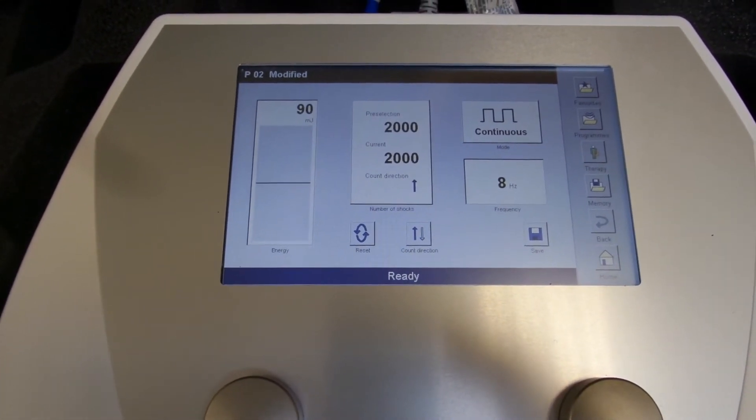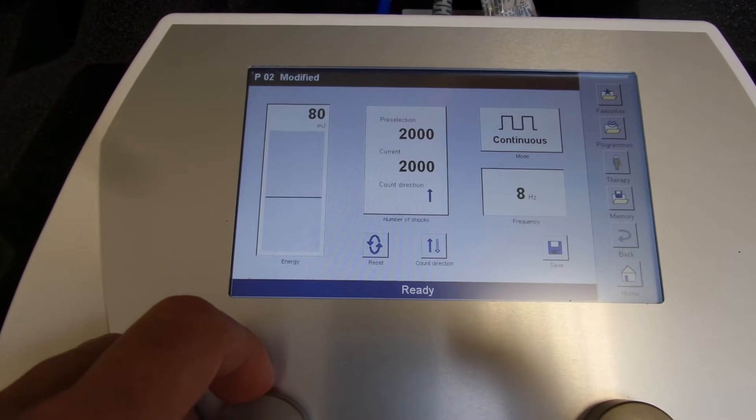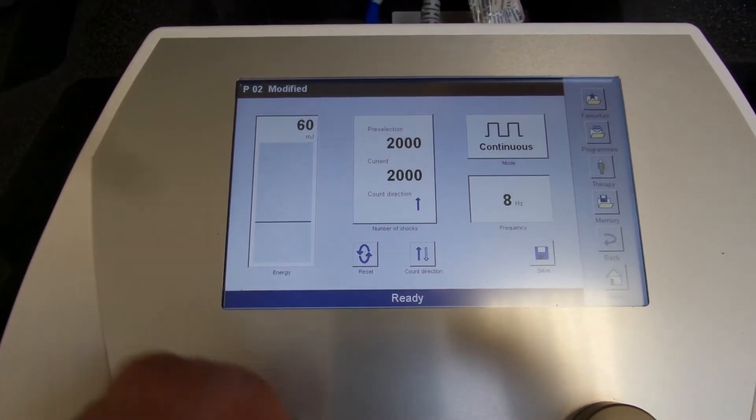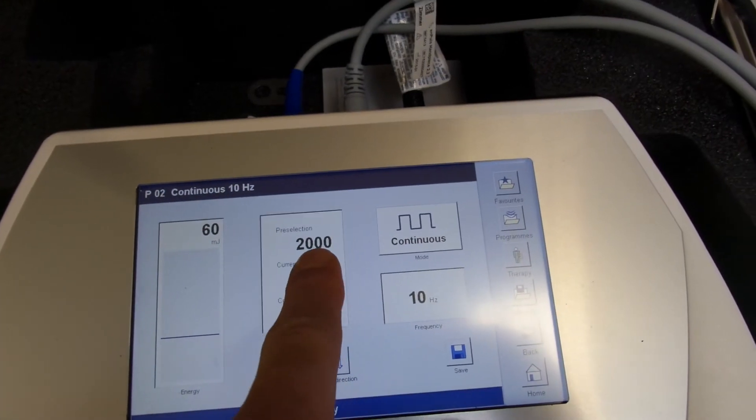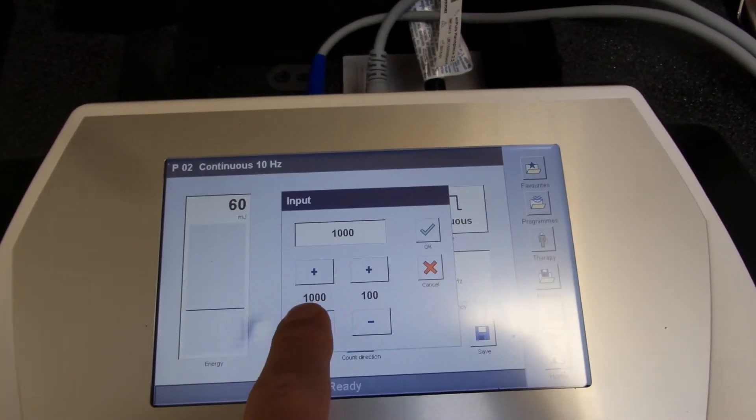Today we're using the Zimmer N Plus to do radio shockwave to the hand. We're going to start with 60 millijoules at 10 Hertz and we're going to use 2000 shocks.